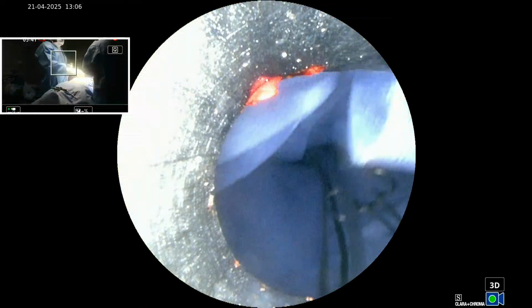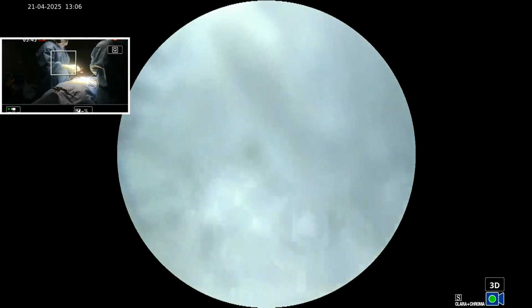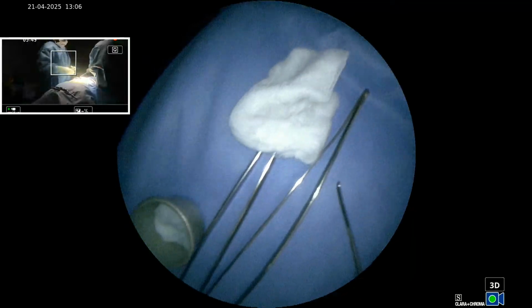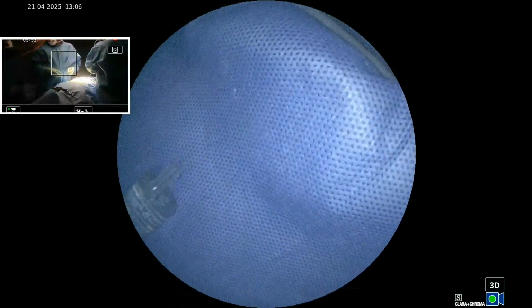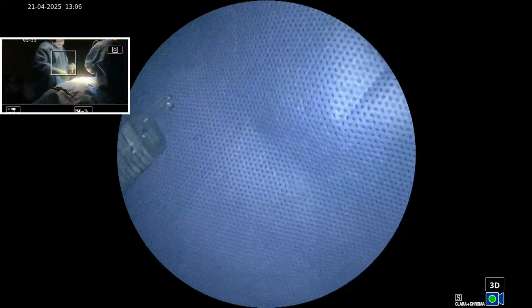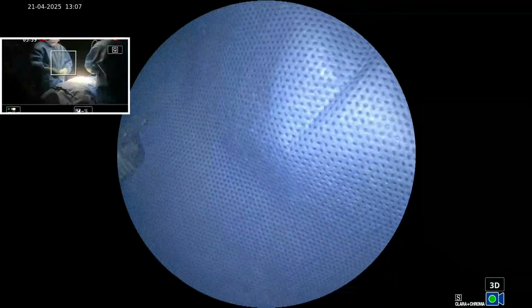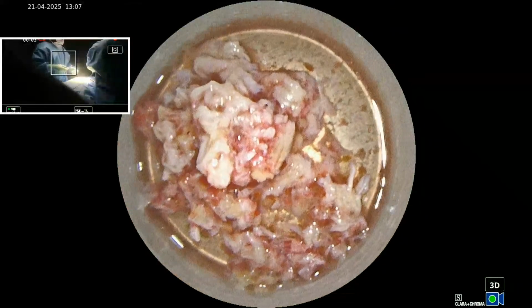So one level discectomy with the over the top bilateral decompression done. Now we'll go to another level, that is the L4-L5. L3-L4 is just finished. This is a right approach. We are planning L4-L5 also from the right approach again. The patient complains from the right, more on the right side.